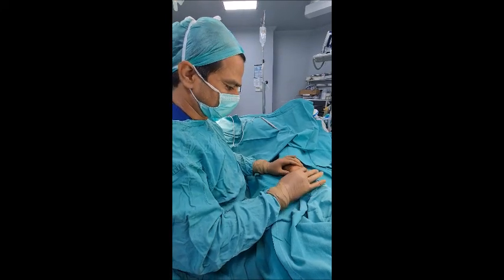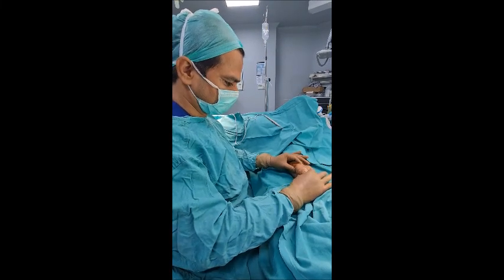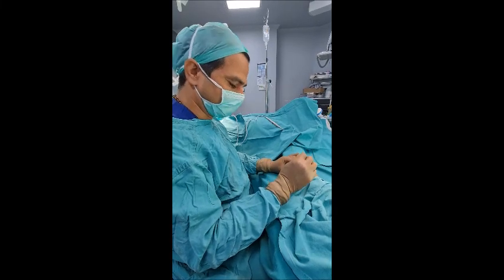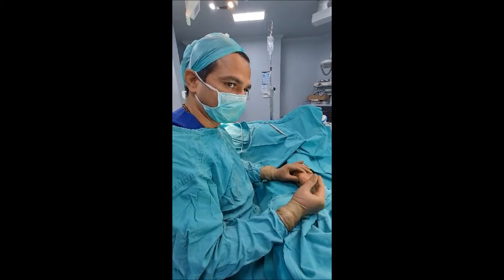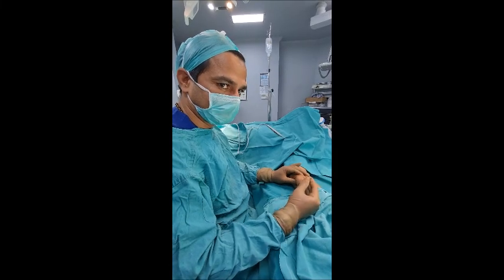With the help of our minimal invasive technique, we can remove this complete big lipoma through a very small hole, which is very comfortable to the patient. If we take a big incision, there is always a chance of infection. Recovery time is also a factor — the patient may have to take rest for a few days.